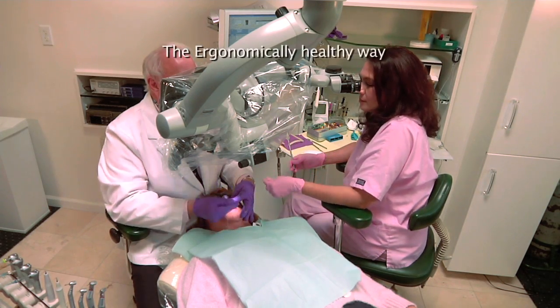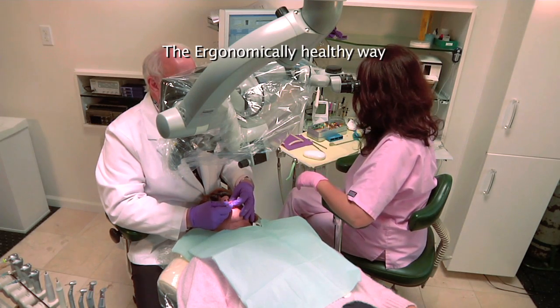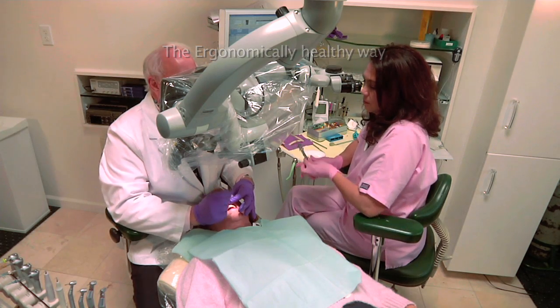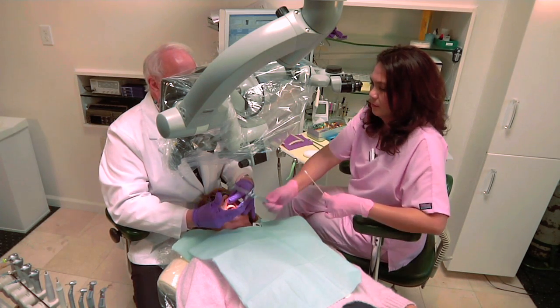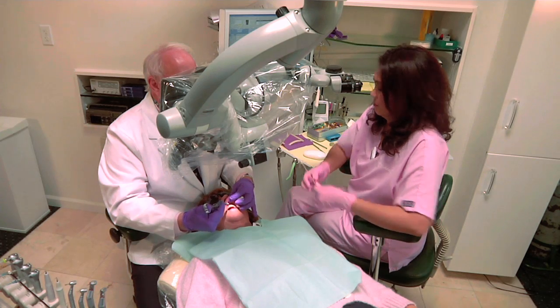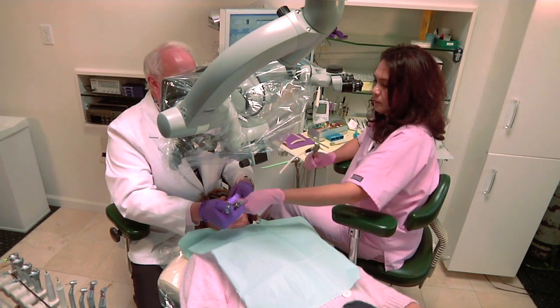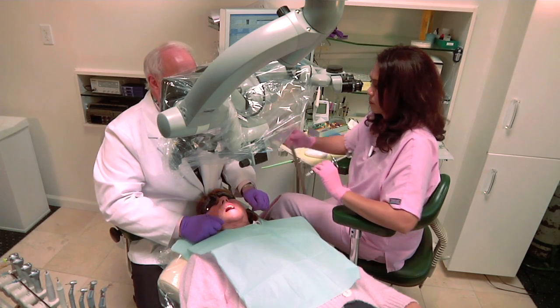This is the correct way to give it under the scope. The doctor is completely upright and comfortable, muscularly at rest, with elbows on the chair rests. This is an upper anterior injection — all done under the scope without a problem.